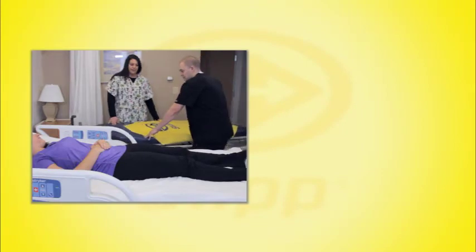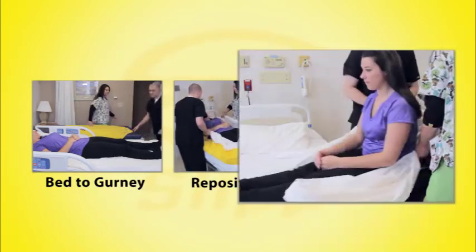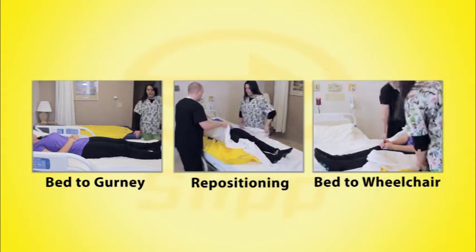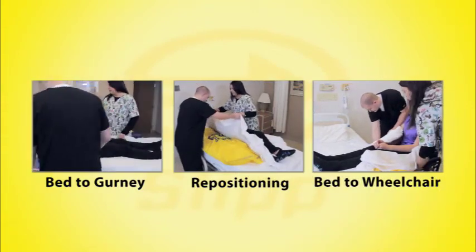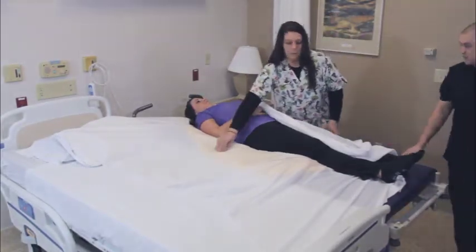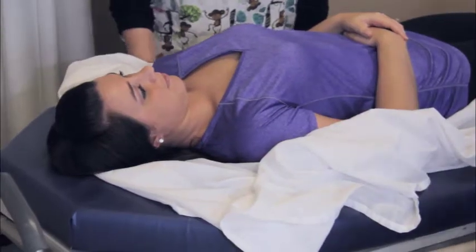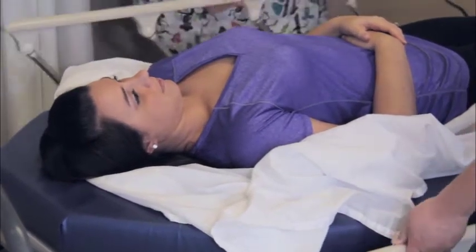Whether using the Slip to transfer a patient from bed to a wheelchair, the patient is not lifted, pulled, or subjected to hard rollers. Unlike most other patient moving devices, Slip works with the patient's weight to achieve a smooth, comfortable move. Both the healthcare giver and the patient feel safe and secure.